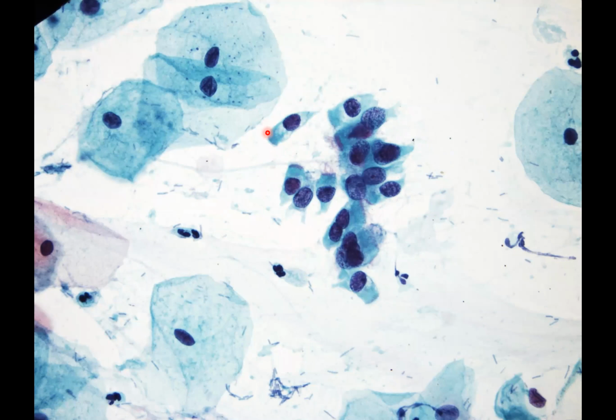This you can orientate. You can just make out that this is the top, and here we've got this little tag of cytoplasm here and here and here, where it's been pulled away from the basement membrane. But look, we've got lovely terminal bars and cilia. So this is tubal change. It's something you quite commonly see, particularly as you go up the endocervical canal. I wouldn't consider putting this in my report.